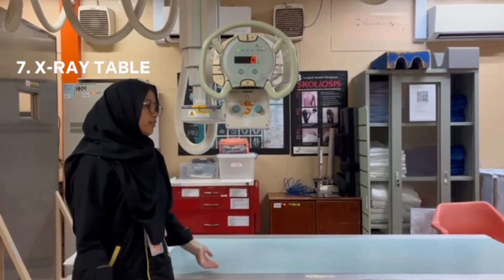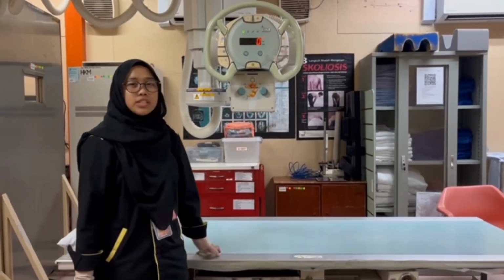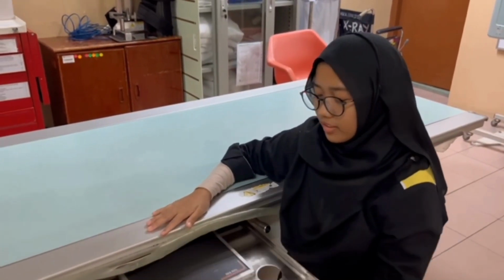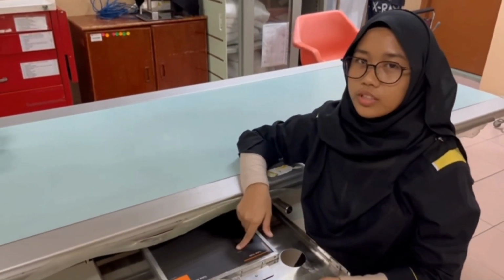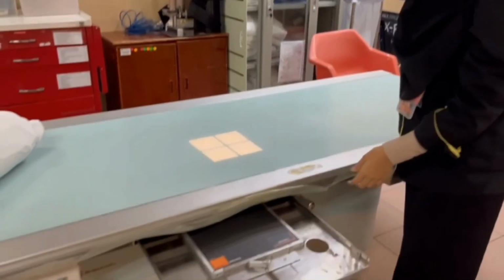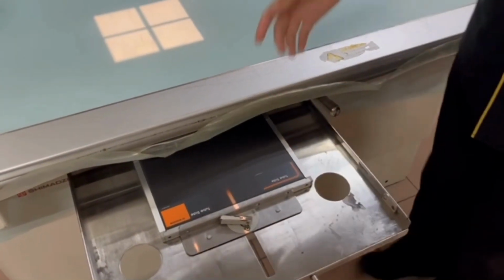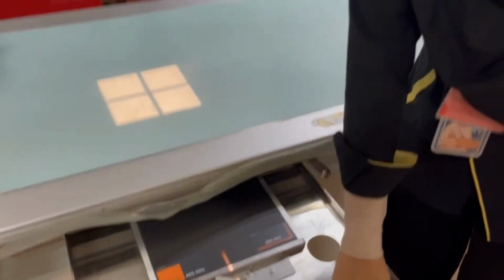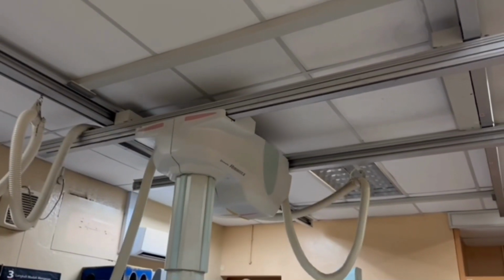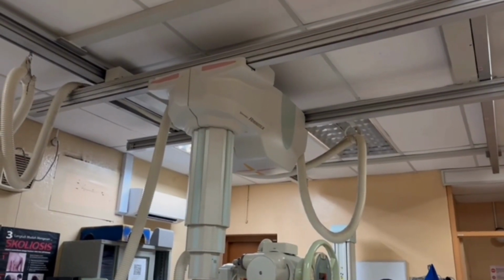And then we have the table, which is usually motorized, so we can position the patient better on top. So next we have a bucky mechanism, which functions to hold the image receptor and align with the X-ray so that we can get a perfect image. As you can see, the entire system is supported by structures like the tube stand or ceiling mounted arms, allowing flexible positioning of the X-ray to accommodate different procedures.